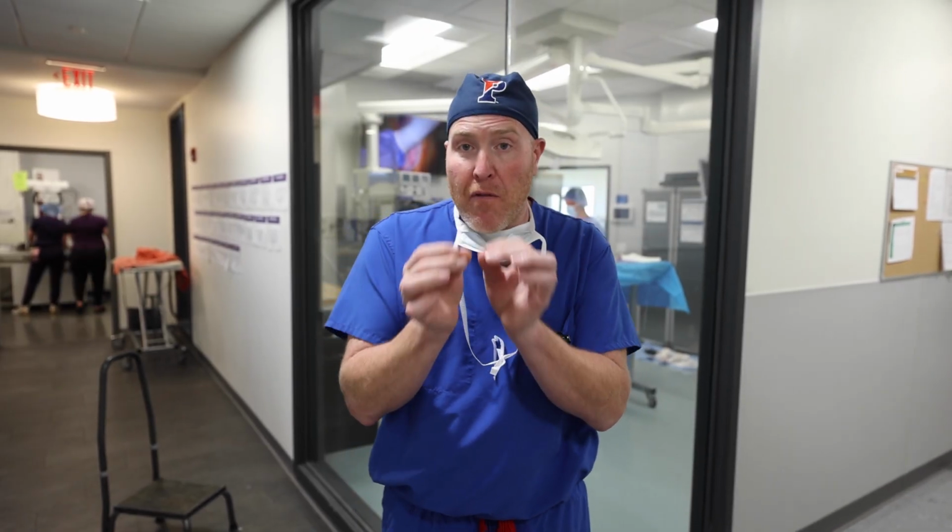So this allowed us to actually do a very big surgery through a very small incision. And ideally, that's one of the big advantages of minimally invasive surgery, is doing big surgery with very tiny instruments with great magnification. So this was excellent. So right now, Mia is recovering very nicely. The foreign object has been extracted, and ideally will go on to an excellent recovery and healing.